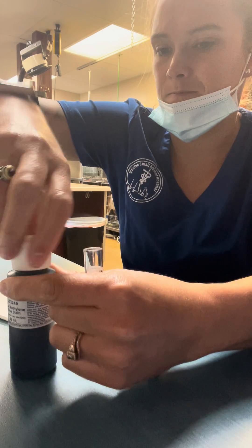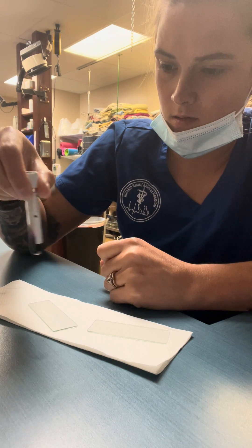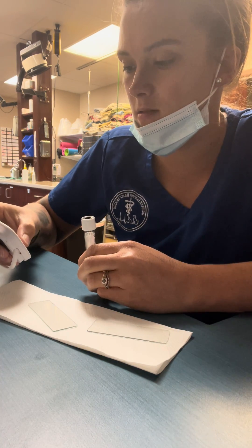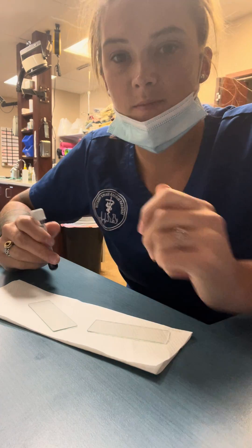Put the top back on. I'm just gonna agitate this a little bit, and then I'm gonna set a timer for 15 minutes. I'm gonna let this sit for 15 minutes and then we'll come back and make our smear.